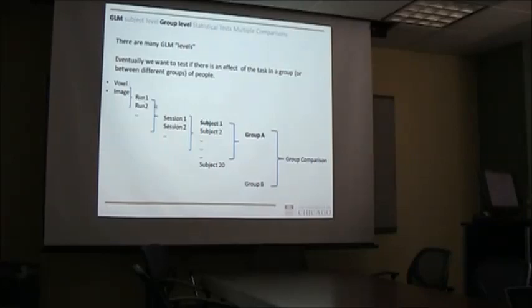And I guess you can look at it a little bit in this way, right? You run this model on a voxel, which you later combine into an image. You might have these images from different runs, so you might sort of chop up your task in shorter parts, say 10-minute parts. You might have like 2 or 3 of these, which you combine into a session.